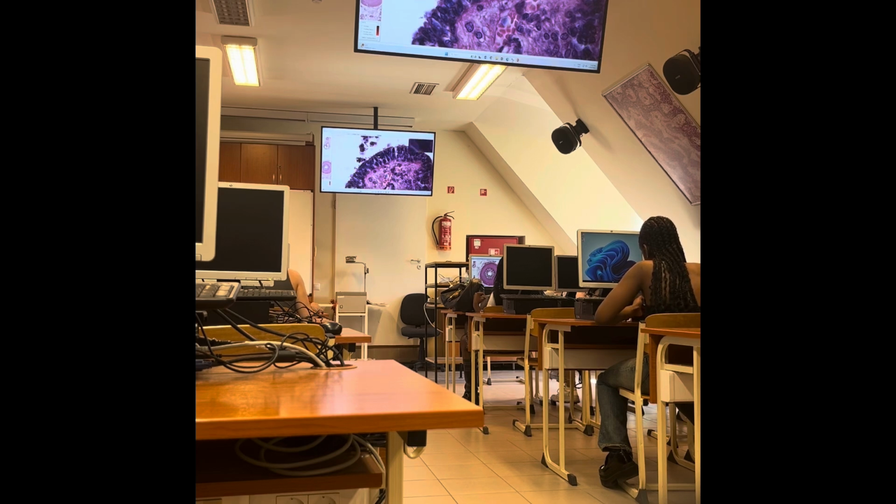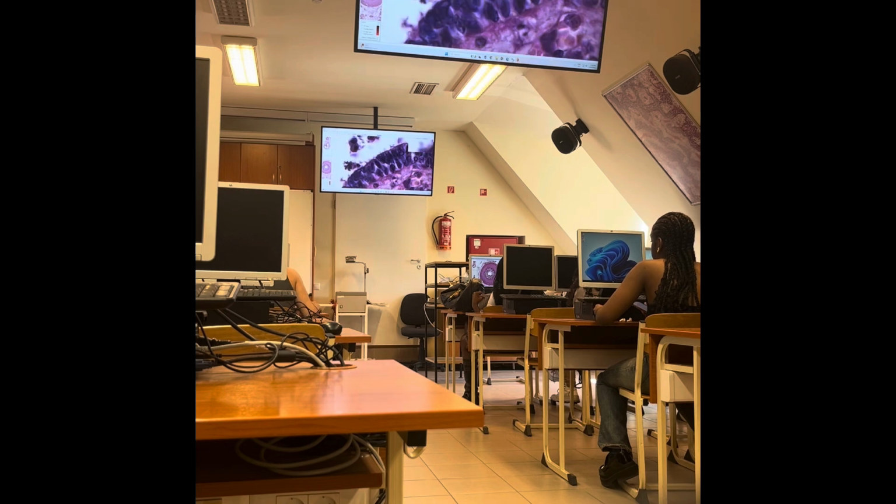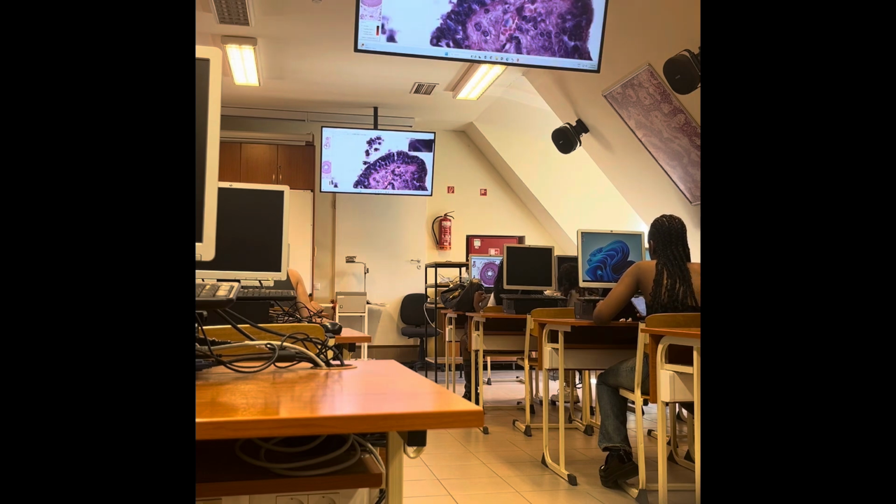The epithelium is the same type as in the other segment. This is the pseudostratified columnar epithelium. And there are also cilia here, though we cannot see their entire extent. I think that is also an artifact. What kind of cilia are present here? Stereocilia. Okay, so the epithelium mucosae is a pseudostratified columnar epithelium with stereocilia.